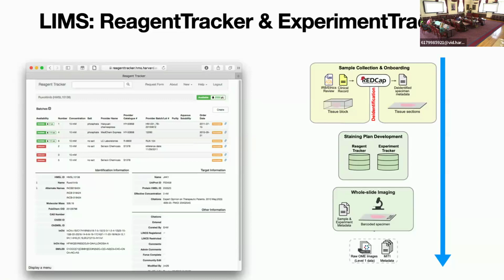in your biology. And then this system also manages project slide IDs and project IDs that we use to name folders and files on disk, because when you've got this many files and this many projects going on at the same time, we need a reliable, rigid naming scheme. That's that.